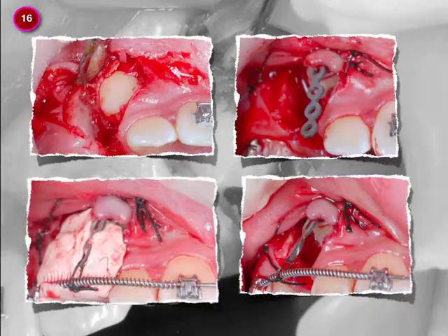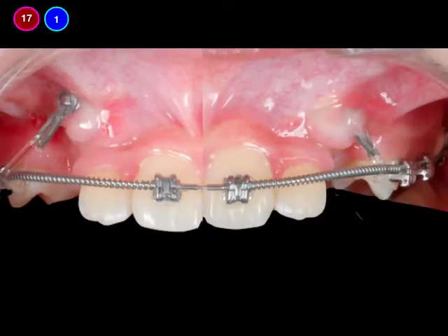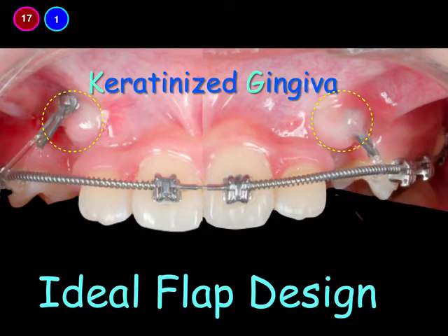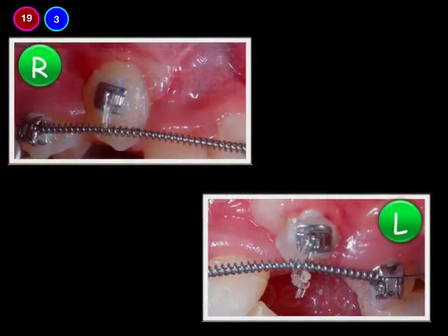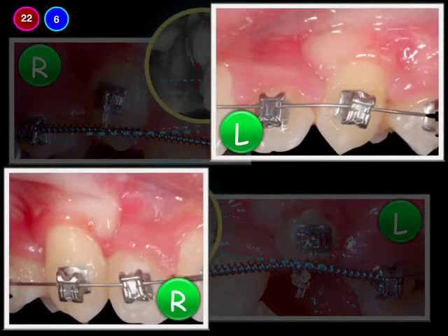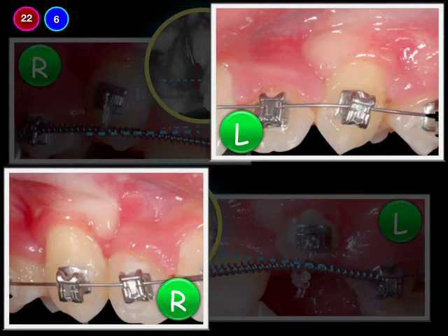The same procedure was done on the other side. One month later you could see that soft tissue on both sides looked healthy because we preserved the keratinized gingiva with ideal flap design. Three months later, the two impacted canines were gradually dragged into occlusion. Then six months later they were aligned into the arch, but we could see some scar formation resulting from the surgery.